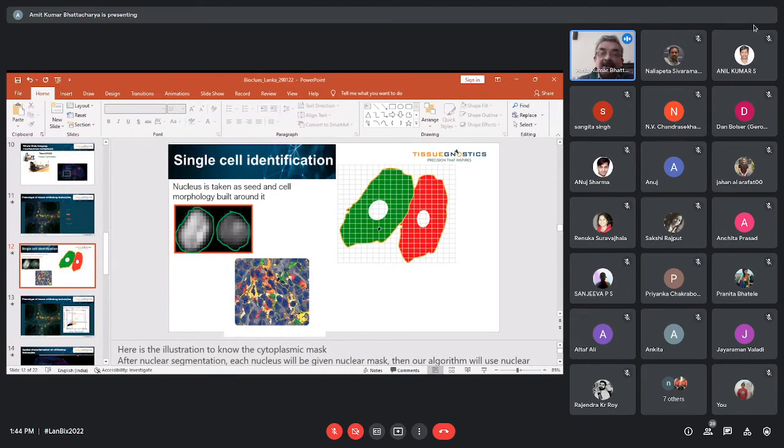This way it delineates the morphology of the cell, and it tells us that is a single cell. So this is a cell stained with one particular marker, this is with another marker, and that's how the cells are stained for different markers. And therefore you can do a cell count based on the types of markers there. So we'll say, for example, in this tissue, there are two kinds of cells, the green cells and the red cells.